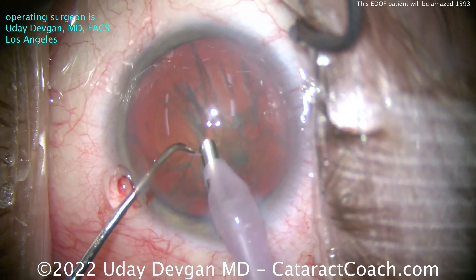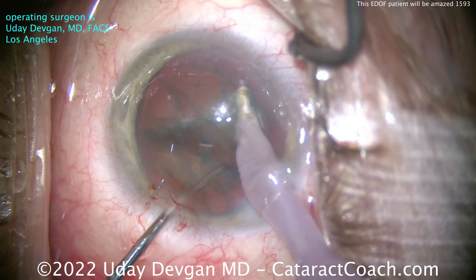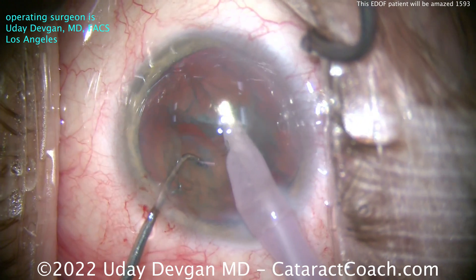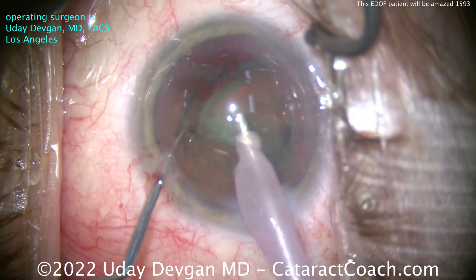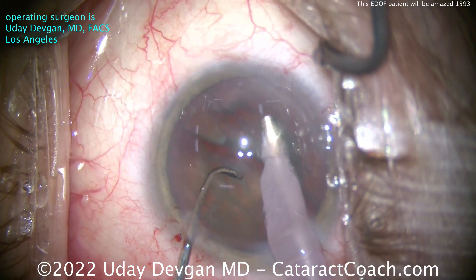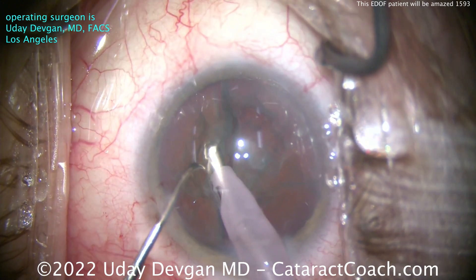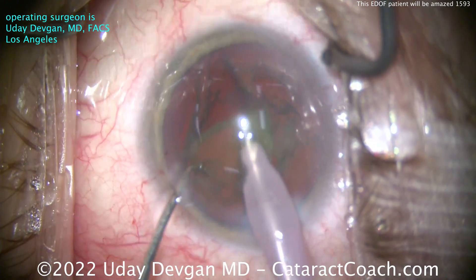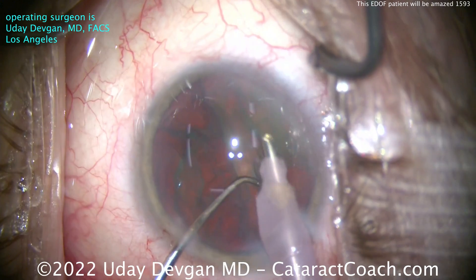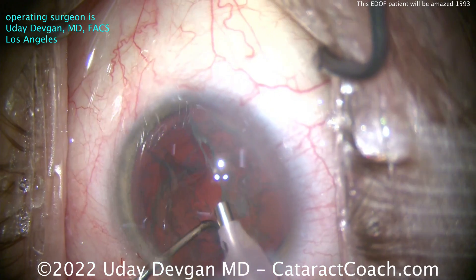In a case like this, looking at the patient preoperatively at the slit lamp, the amount of cataract or nuclear density means I can improve the patient's post-op night vision. With this EDOF lens, the patient at nighttime has much better night vision than he had preoperatively with his contacts or glasses — so that's a net improvement, and patients are going to be happy. Here we see we've chopped the cataract in half, bringing one half out of the bag and emulsifying it. Not a very dense cataract, maybe two-plus nuclear sclerosis — another factor confirming we can make the patient's night vision better.